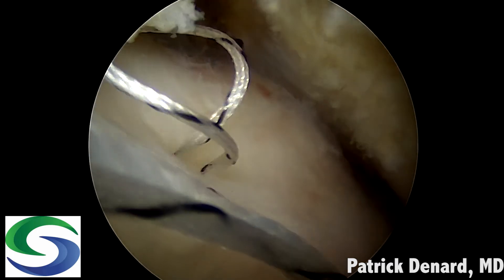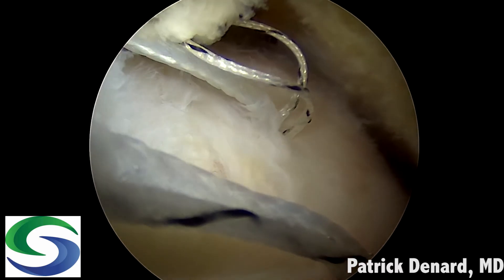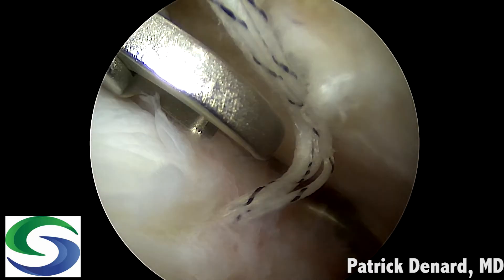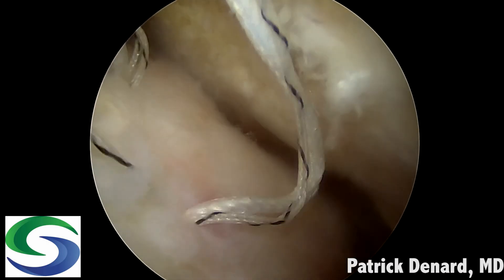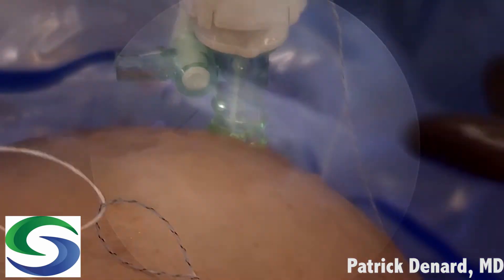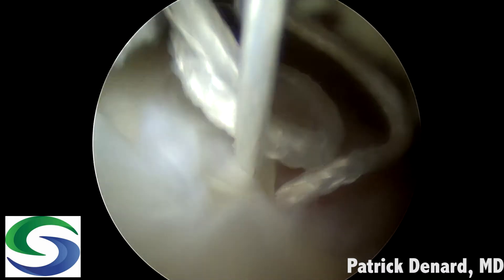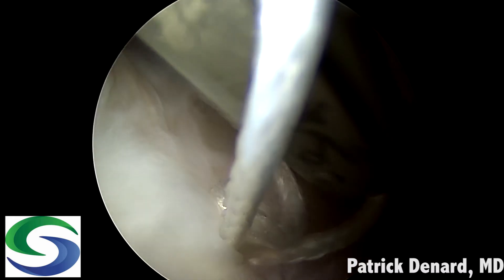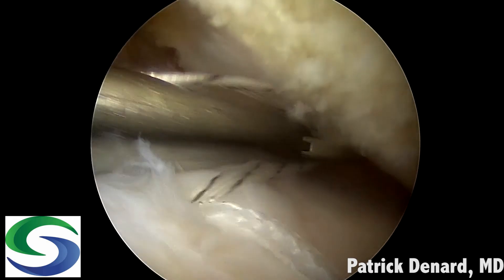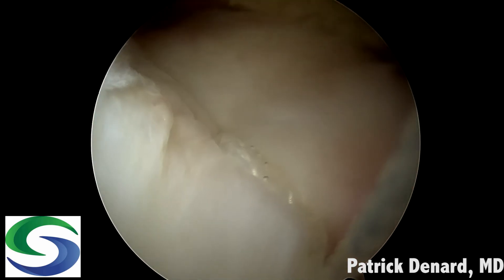I take the number five suture from the anterior anchor. Then posteriorly I retrieve a shuttling suture — pushing sutures out of the way and pulling back on the loop, my assistant delivers a loop so I know exactly which suture to retrieve. Outside the cannula I pass the number five through the loop, then pull on the other end of the loop suture to deliver the number five suture into the sheath. The suture from the anterior anchor is delivered into the sheath of the posterior anchor. Then I retrieve the posterior suture — the one that's slack — and pass it into the anterior anchor, and there I have my double mattress suture.